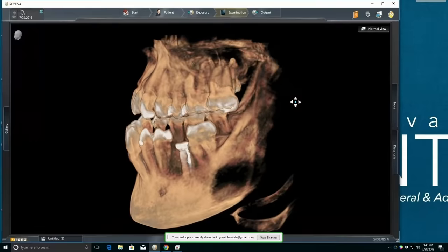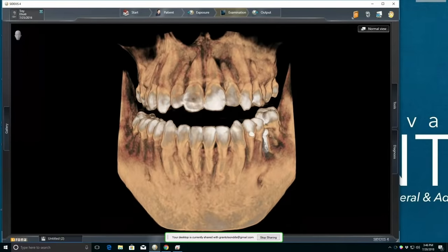So got a wonderfully placed implant for us to put a crown on here in about 4 to 6 months. Typically like 6 months in that area because of the bone, make sure it's fully healthy. And then the fact is that tooth, I'm sure Trey's gonna wanna eat some good food with that, chomp on some pretty solid stuff, chew through some good steak, beef jerky, all that type of stuff. So we want that implant crown to be solid.